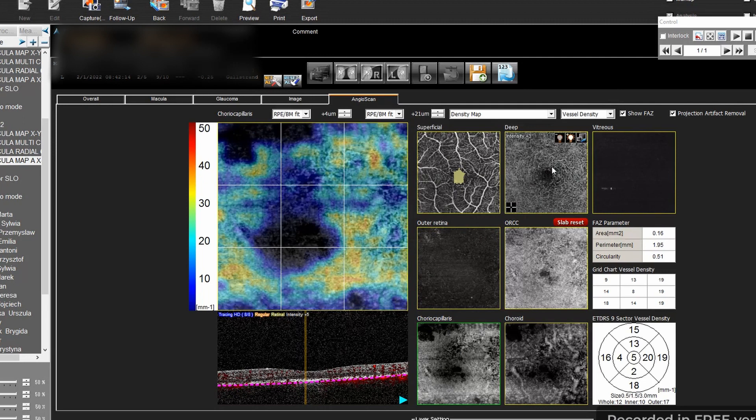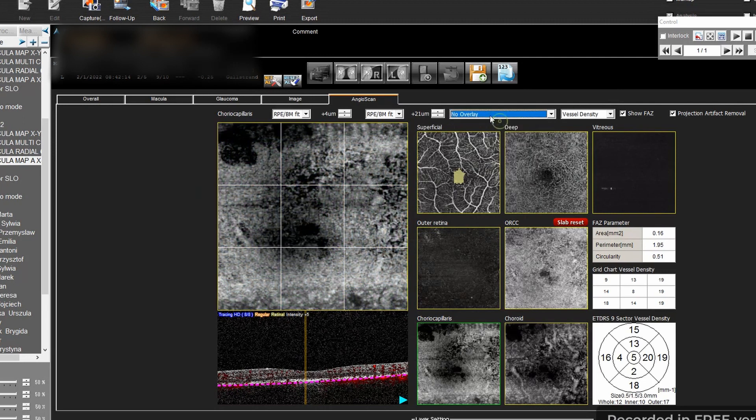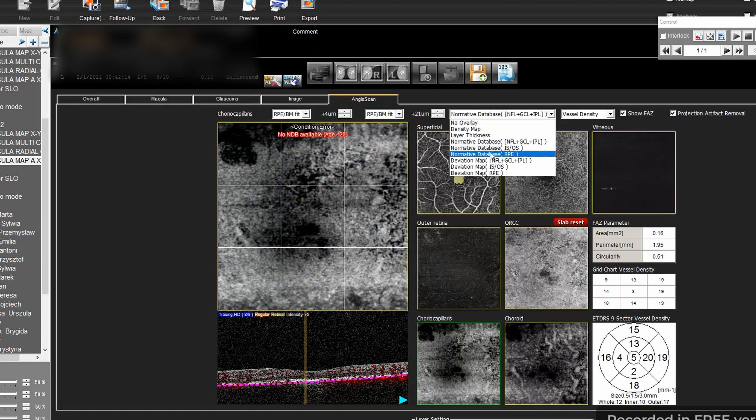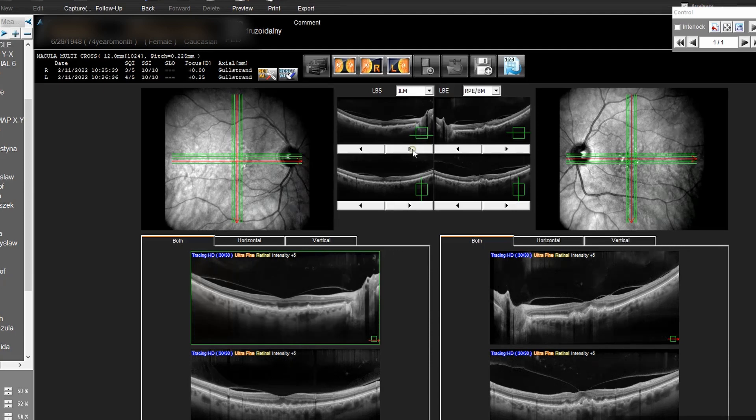You can naturally see maps. There are sorts of parameters. There's automatic FAZ measurement and also the measurement of the CNV.